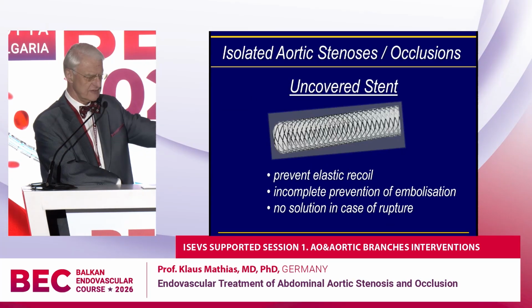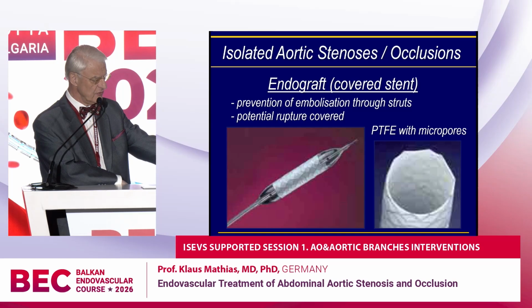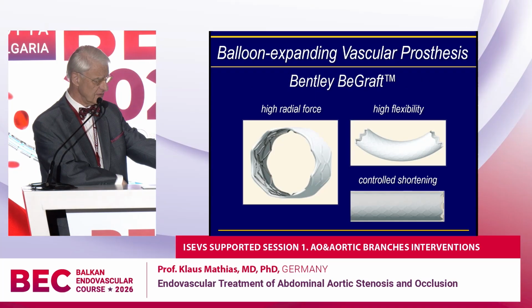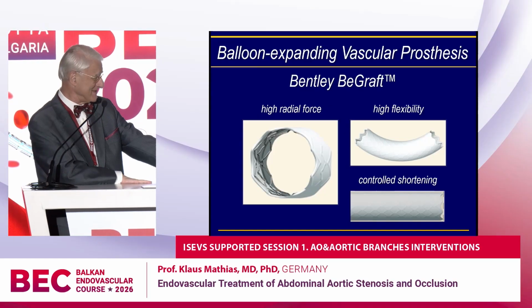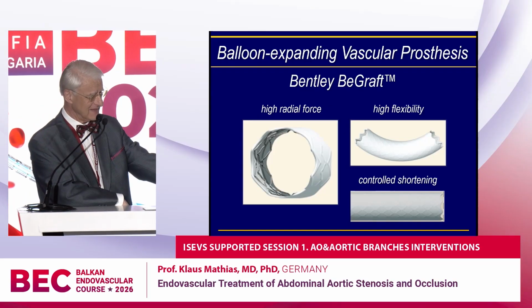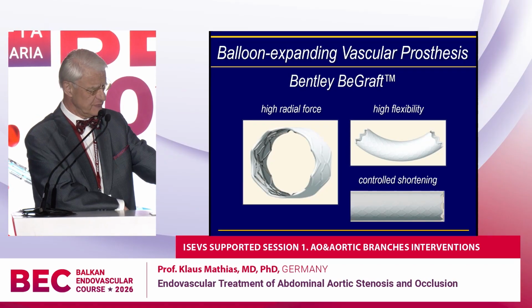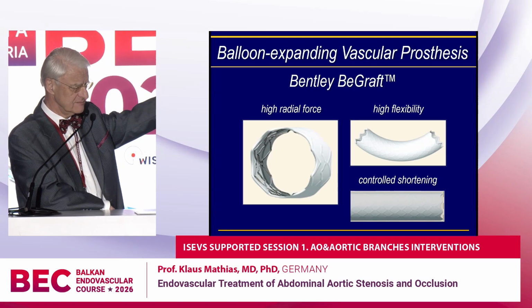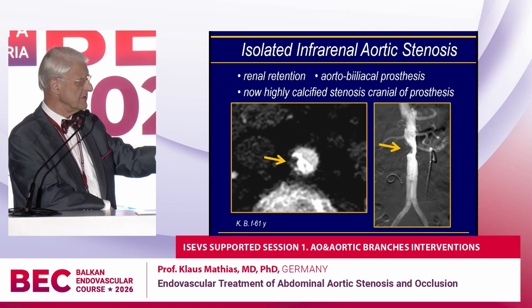It's not running smoothly. So we have different endografts now available for that, and we work with them. Now it's running without my doing, so a little bit unusual. I like the Bentley BeGraft for this purpose, to deal with these aortic lesions.